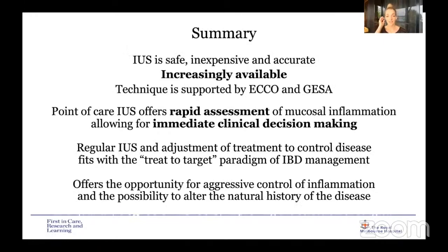So in summary, intestinal ultrasound is safe, inexpensive and accurate. It's increasingly available. In Australia, where I live, about 6 years ago, there was probably one centre that performed this, and now it would have to be greater than 10. It's a technique that is supported by ECCO and GESA, which is our Australian Gastroenterological Society. It's a point of care test.